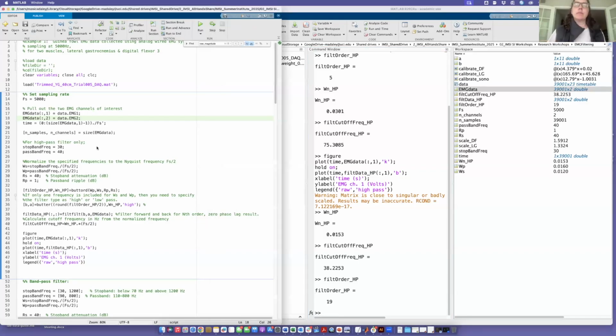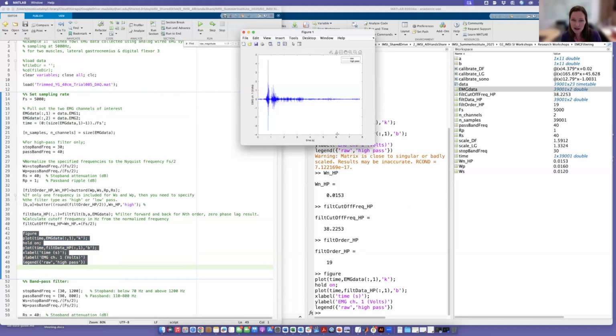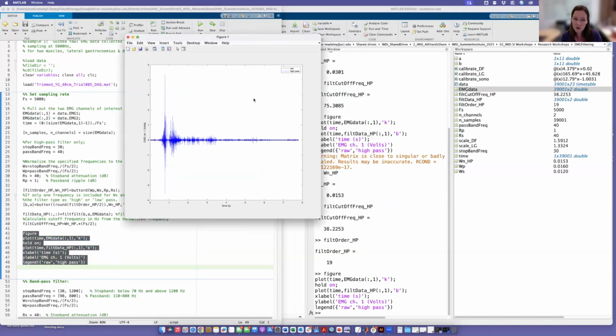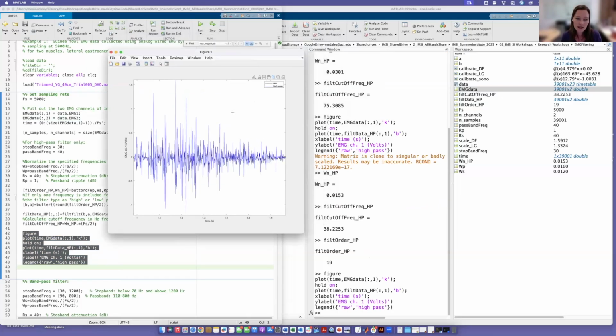Monica, yeah, if you're using something with that high of an order, is that reliable data? I mean, it doesn't have anything to do with the raw data, right? This is just a filtering choice. But I think it's important to look at your filtered and your raw data and compare them, and see if you're getting something weird that doesn't look real that you've introduced into the signal. That's the main thing: do a reality check every time.